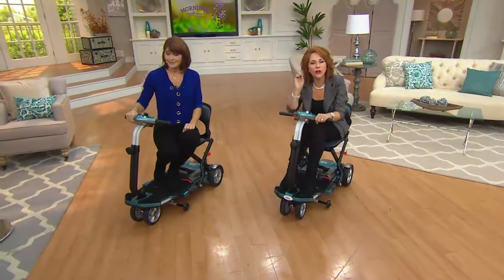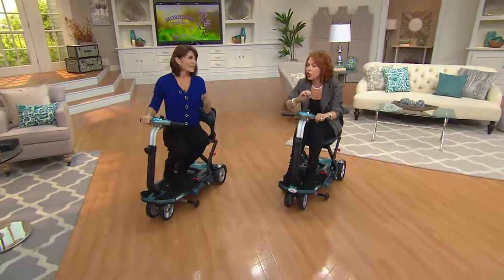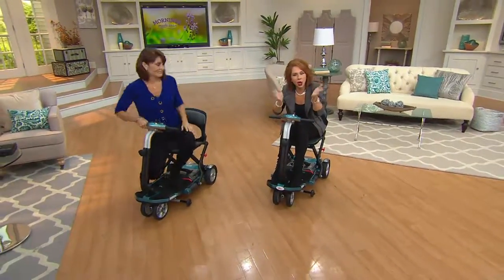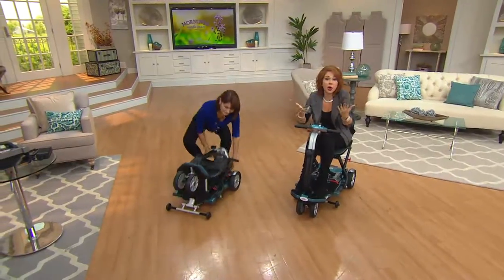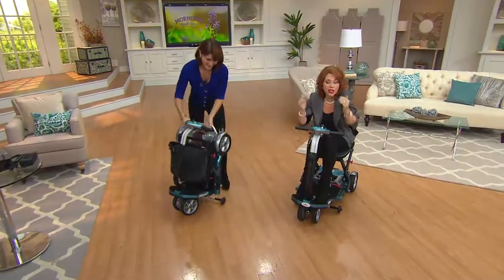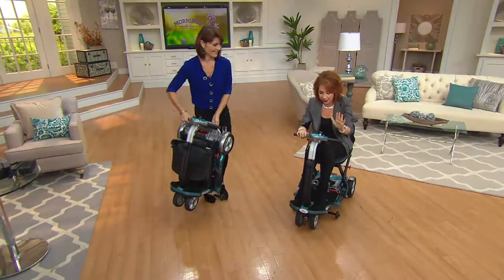How long does it take to fully charge it? It's about two hours. Two hours to fully charge it — it's not something that needs to charge overnight. You don't have to spend half your day sitting at home waiting for it to charge for six hours. That could be while you come home and eat lunch — two hours and it's fully charged again, ready to go another 10 to 15 miles.